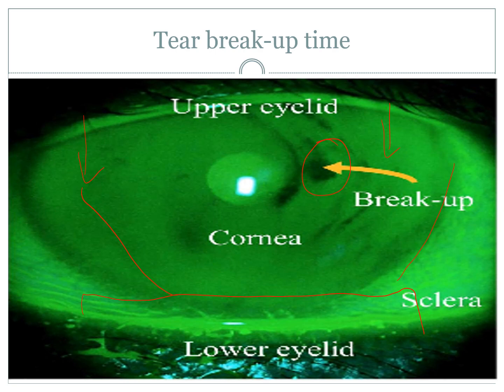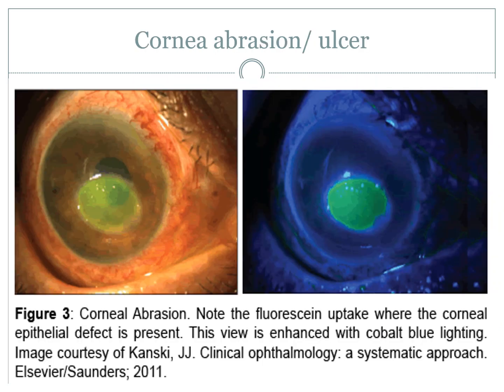The second test that we'll look at is when you look for corneal abrasions. Now, Fluorescein can be a very useful tool for looking for these abrasions. It also is used for ulcers. You have herpes infections as well, and really bad cases of dry eyes can also cause these ulcers to form.